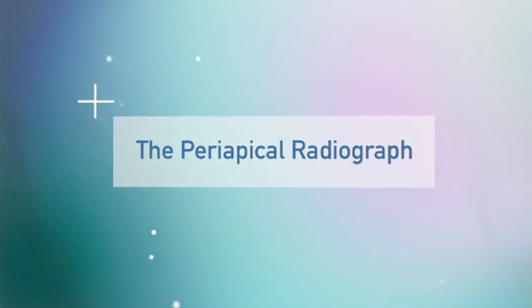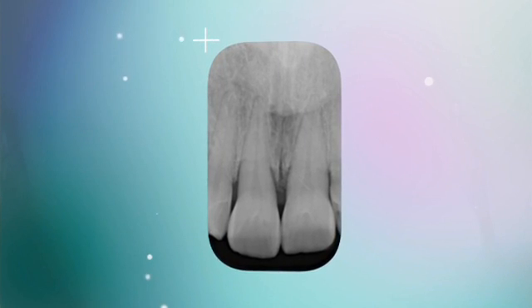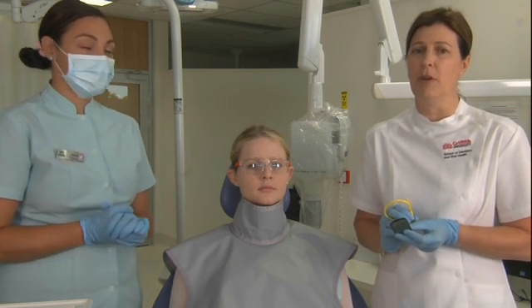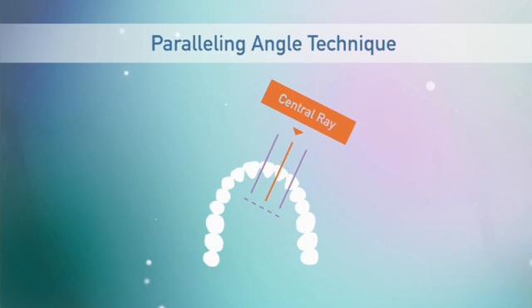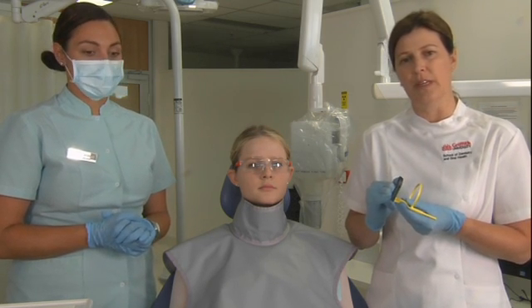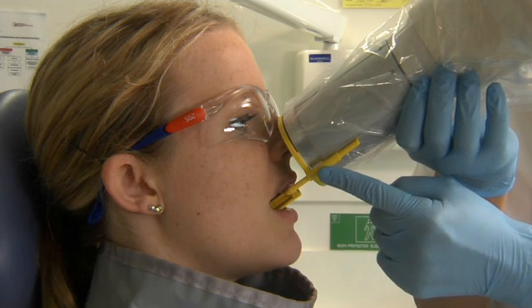The next part of our demonstration will be a periapical x-ray of the patient's upper incisors. Periapical x-rays differ from bitewings in that they expose the full length of the tooth, so in this case we use a paralleling technique. The paralleling technique is the most common type used to take a periapical x-ray. The principle is that the x-ray sensor and the long axis of the tooth are aligned parallel. The positioning of the sensor within the holder is in a portrait configuration, and our orientation marker for a periapical x-ray is always towards the occlusal surface. The long cone is positioned over the ring of the x-ray holder with the handle parallel to the long axis of the cone.